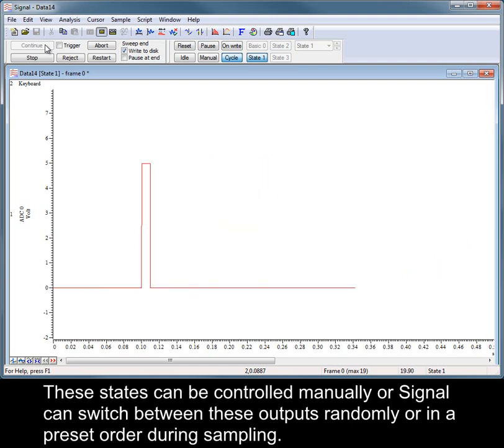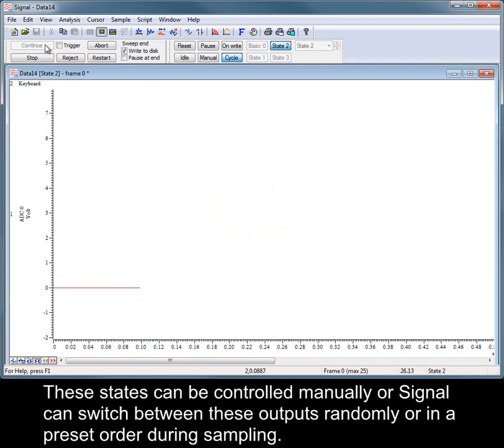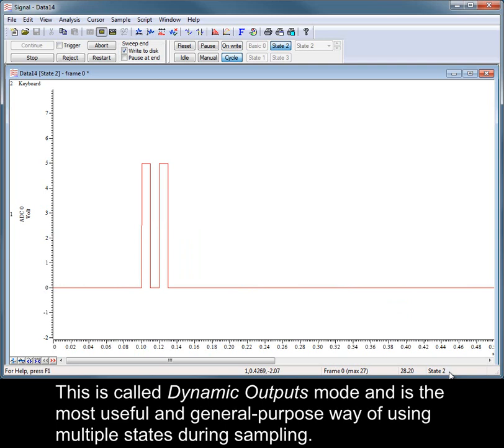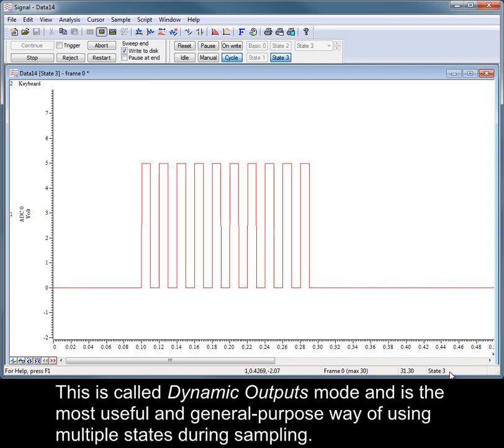These states can be controlled manually, or Signal can switch between these outputs randomly or in a preset order during sampling. This is called dynamic outputs mode and is the most useful and general-purpose way of using multiple states during sampling.